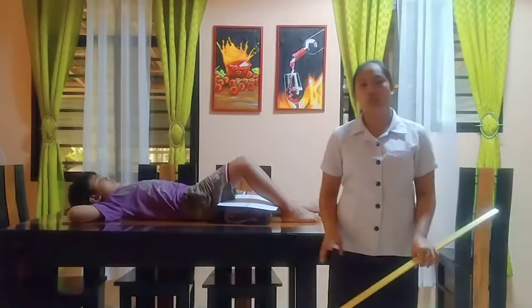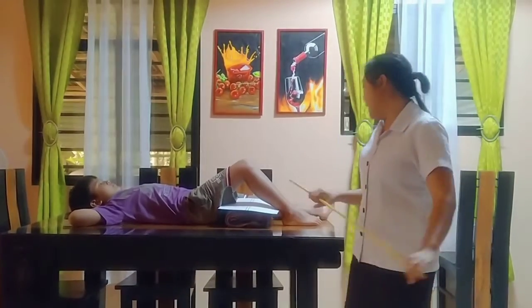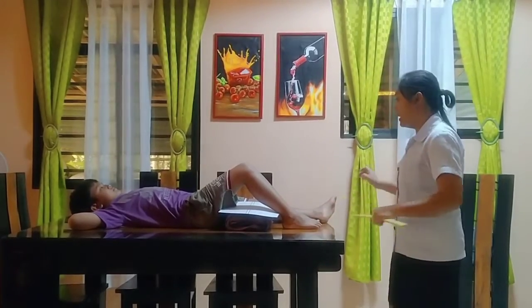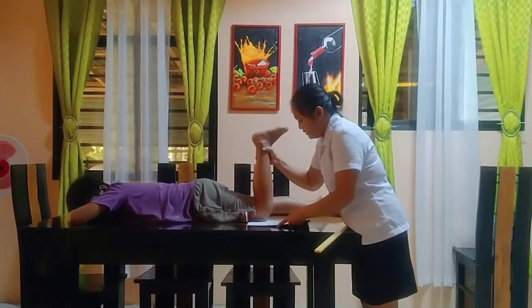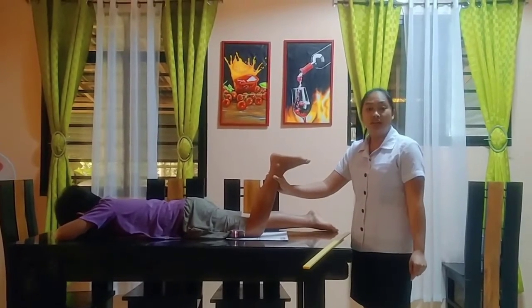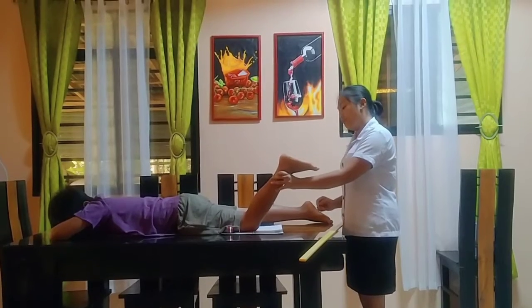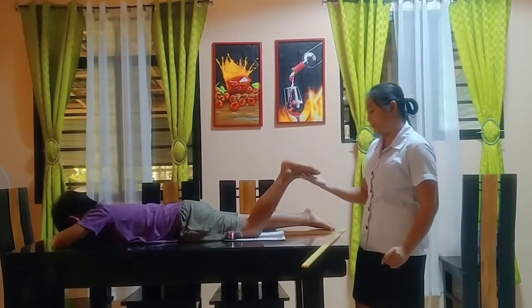Next projection will be the Camp-Coventry method. So, kailangan po naka-prone ang patient natin. Okay. Ilalagay po natin dyan ang paa ng patient. The knee is flexed 40 to 50 degrees. Ayan.